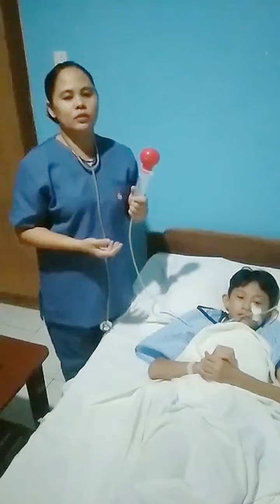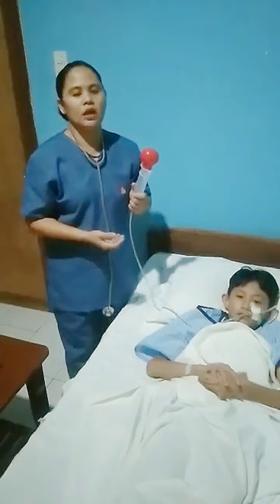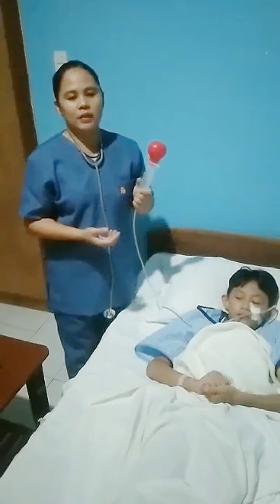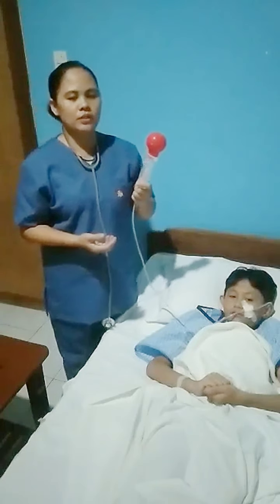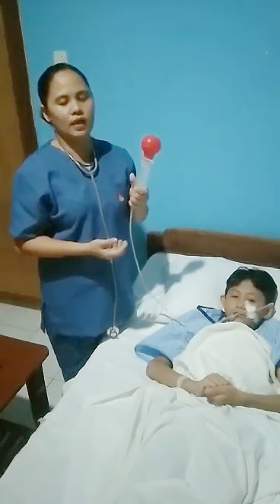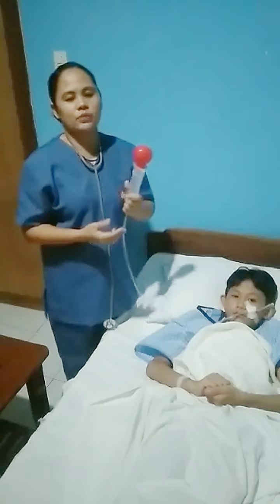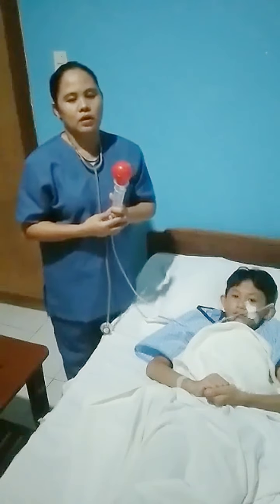Measuring the residual volume will help us to check how much feeding to give. If the physician orders 110 ml of feeding, and there's 10 ml of residual volume here, we can just deduct the amount of aspirate, which is 10 ml, from the 110 ml of order. So it means that we may give 100 ml of feeding to our patient.